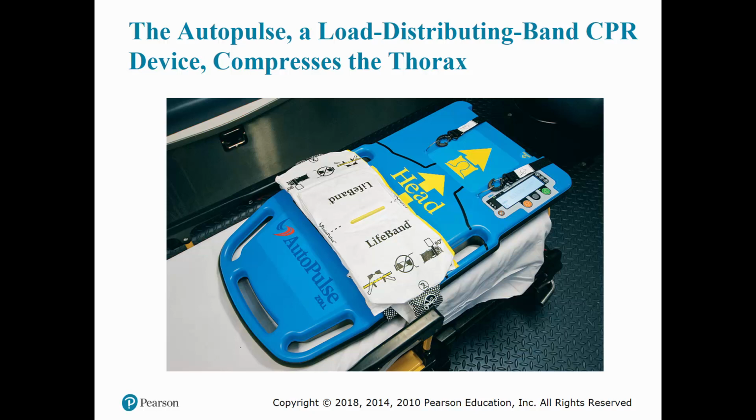These are auto pulses, which are very handy and nice to have.